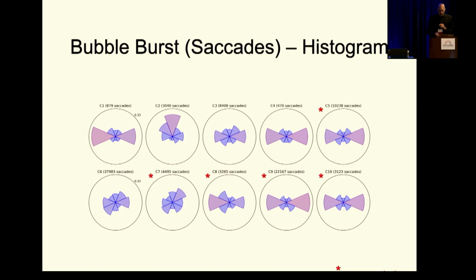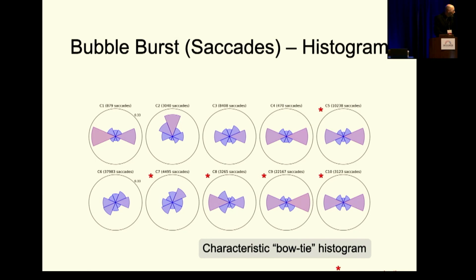And the typical pattern that we have for normal individuals is like this, where you have a bow tie kind of thing. You move better on the horizon. It's also a rectangular screen, and so you can see you have more movements and so forth. The other thing is, I'm showing you on each one of these slides children that are communicative and non-communicative. So you can see here is a typical bow tie kind of configuration, where we move better on the horizon than up and down, and quantify it in a variety of orientations.